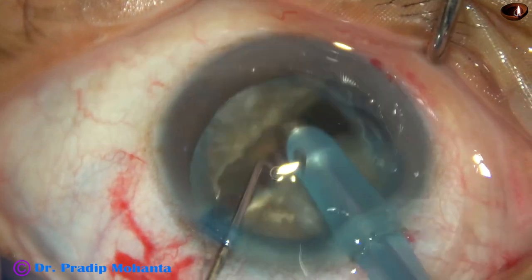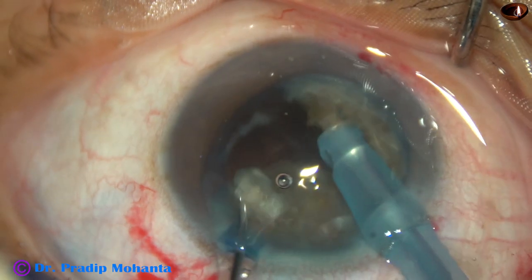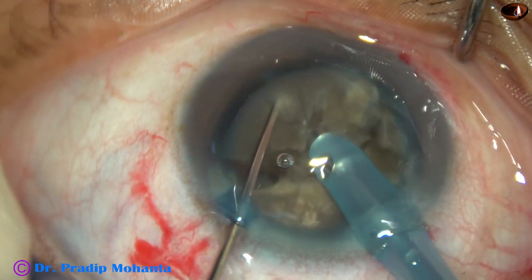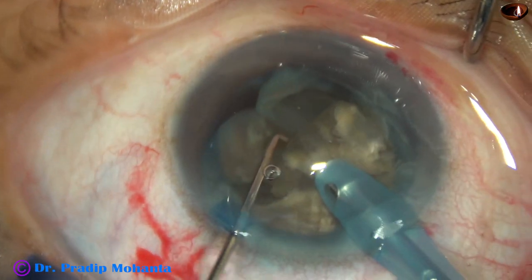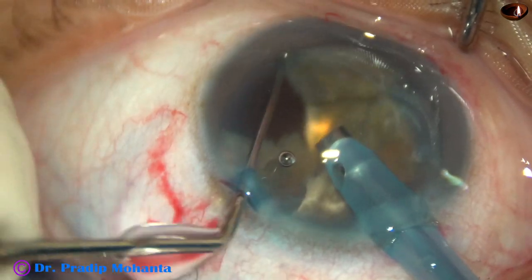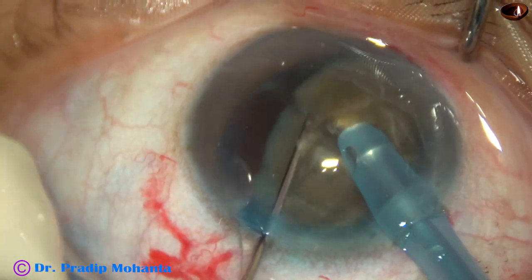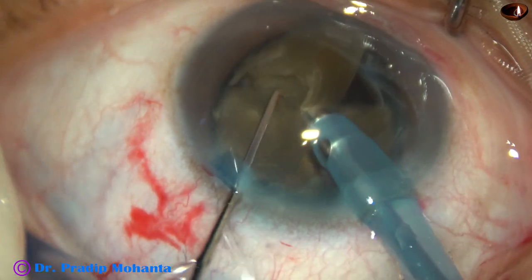Each hemi-nucleus is further subdivided into smaller parts. In this case, one hemi-nucleus has been divided into three fragments and the central fragment is emulsified. The other hemi-nucleus is then divided. PHACO power used is 70%, flow rate is 40 ml per minute, and vacuum is 400 mmHg.